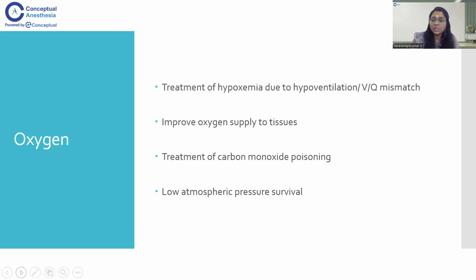So these oxygen therapies are given to patients who are going under anesthesia because basically the patient is not going to breathe. You are going to supply them with oxygen. Somewhere around 0.5 or 0.6 FiO2, like 50 to 60%, is tolerable. And WHO some time ago said that 80% should be the tolerable FiO2 which should be used. So in the ICU setting, depending upon the patient's ventilatory demand and oxygen demand, the patient may require either face mask support or invasive ventilatory support.